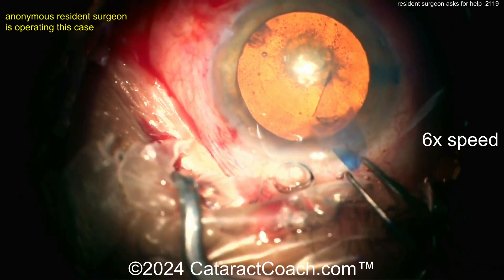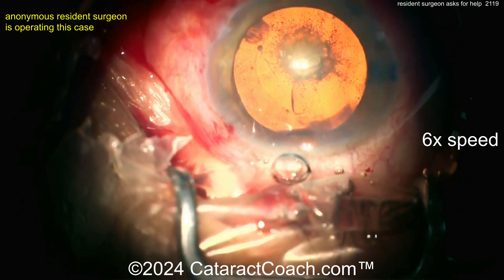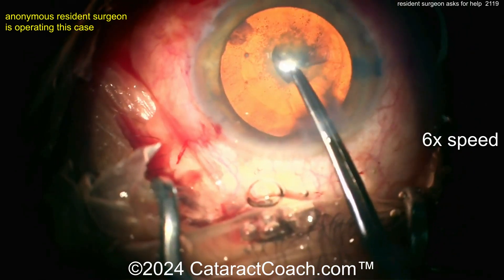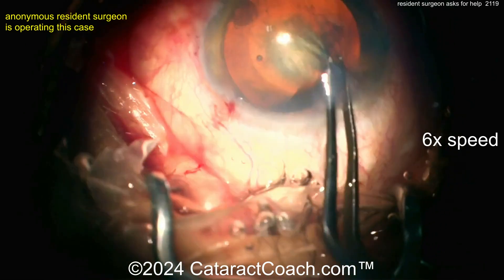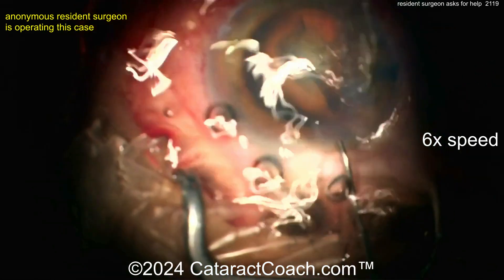Here comes the rhexis. The focus is a little bit better now. The rhexis is reasonable, but you can see the incision is a little bit too anterior — I'd rather have it more towards the limbus. Now losing the rhexis there a little bit, and that's probably because you weren't pivoting in the incision, so you lose viscoelastic. Now kind of completing this rhexis — almost done.